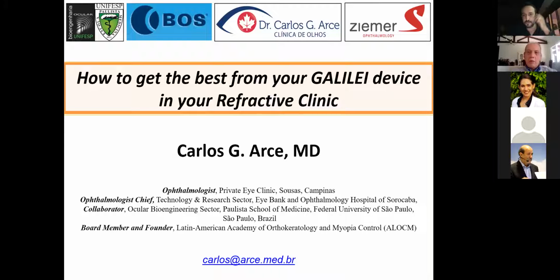So we can see here your lecture, Carlos. Can you see the mouse? Yeah, we can see the mouse as well. Thank you.